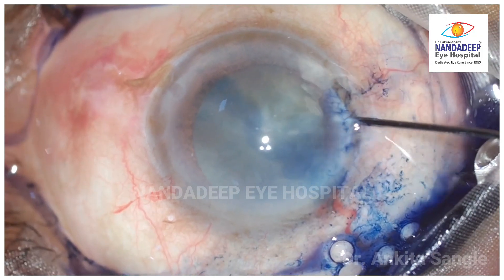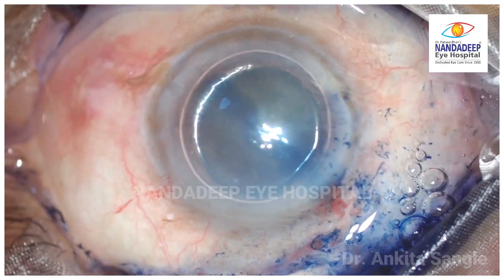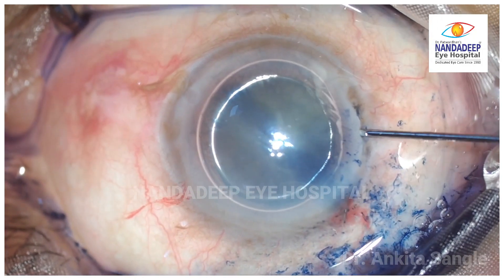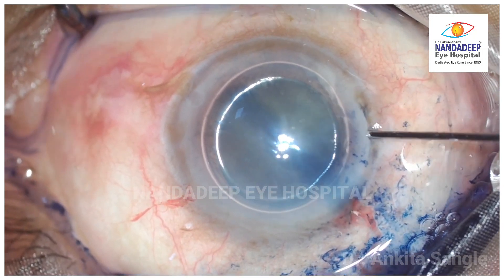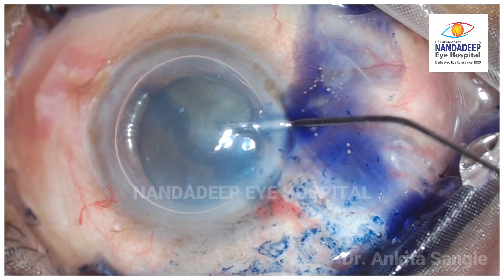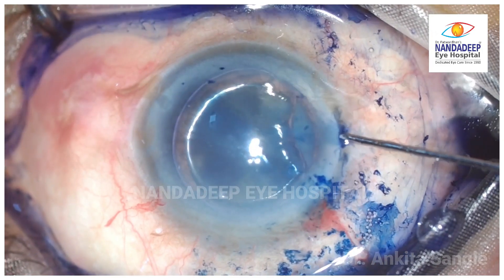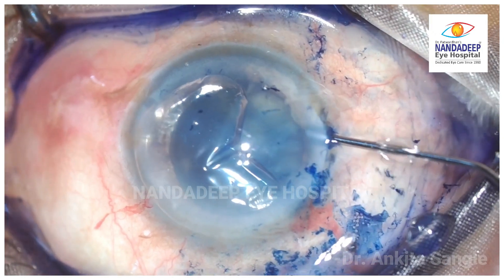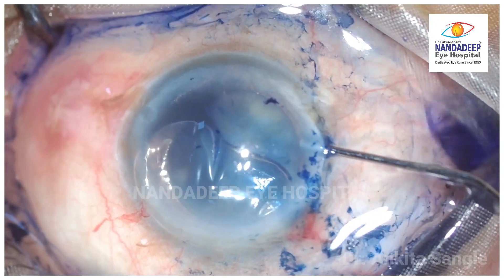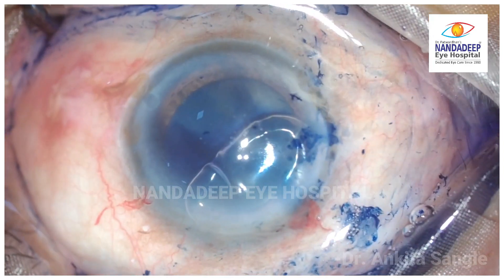He further continues the same from another incision and the detachment is near total. Thinking that he has finally entered the anterior chamber, he continues to stain the capsule. Finally, realizing that something is wrong, it is already too late. The entrapped air above the Desmet Membrane is removed and then the detachment is sealed with a tight air bubble.